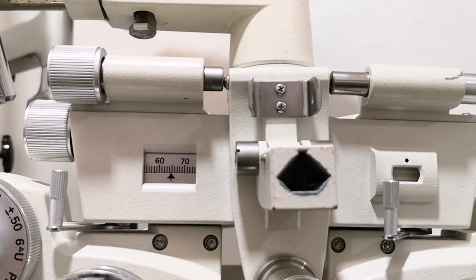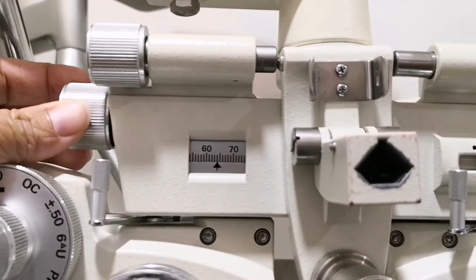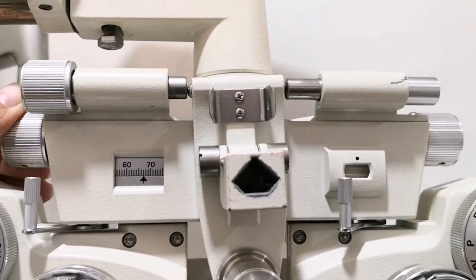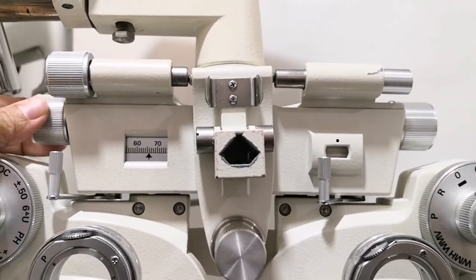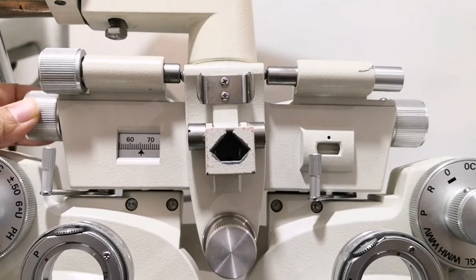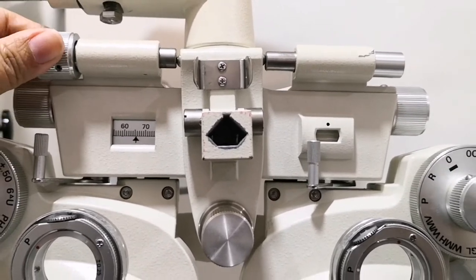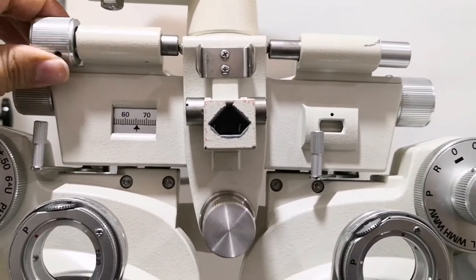Last is the adjustment. It is composed of the PD knob or pupillary distance knob. It controls or adjusts the PD according to the patient's PD. And we have the leveling knob with spirit level.